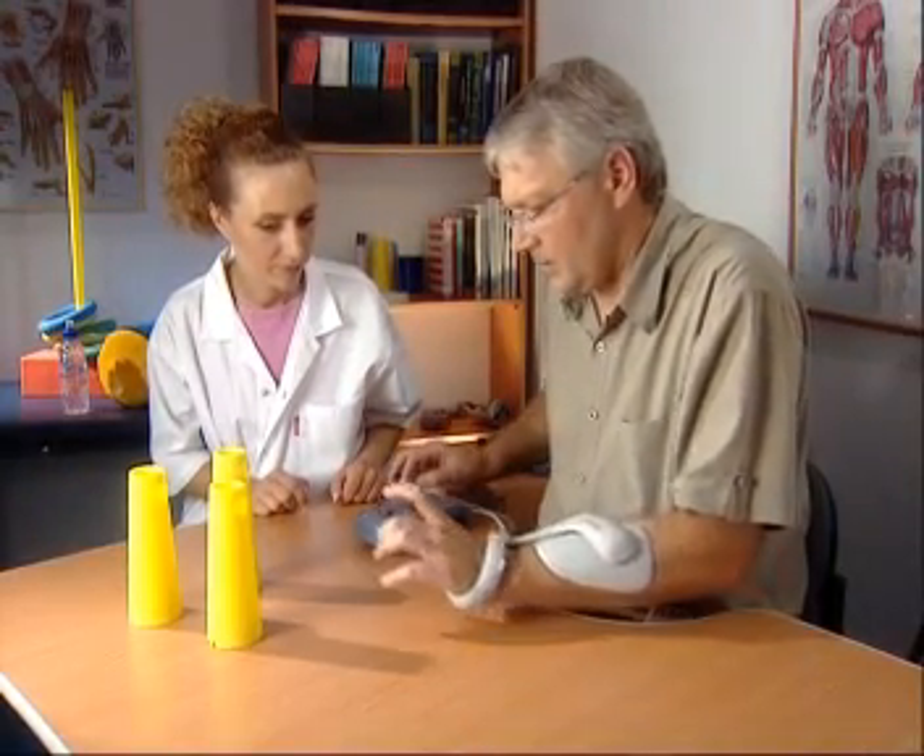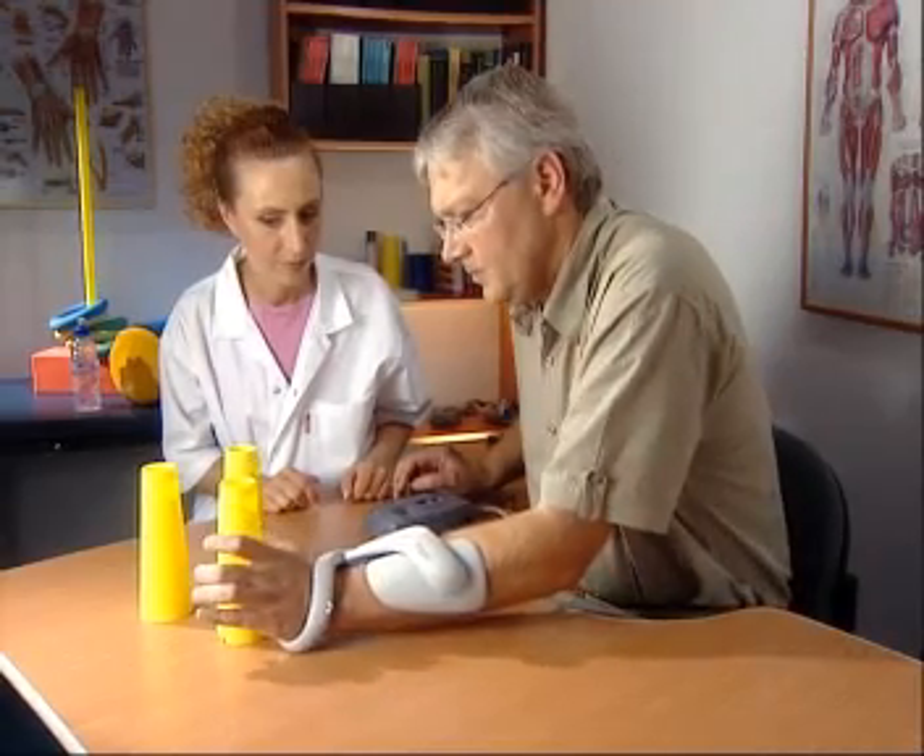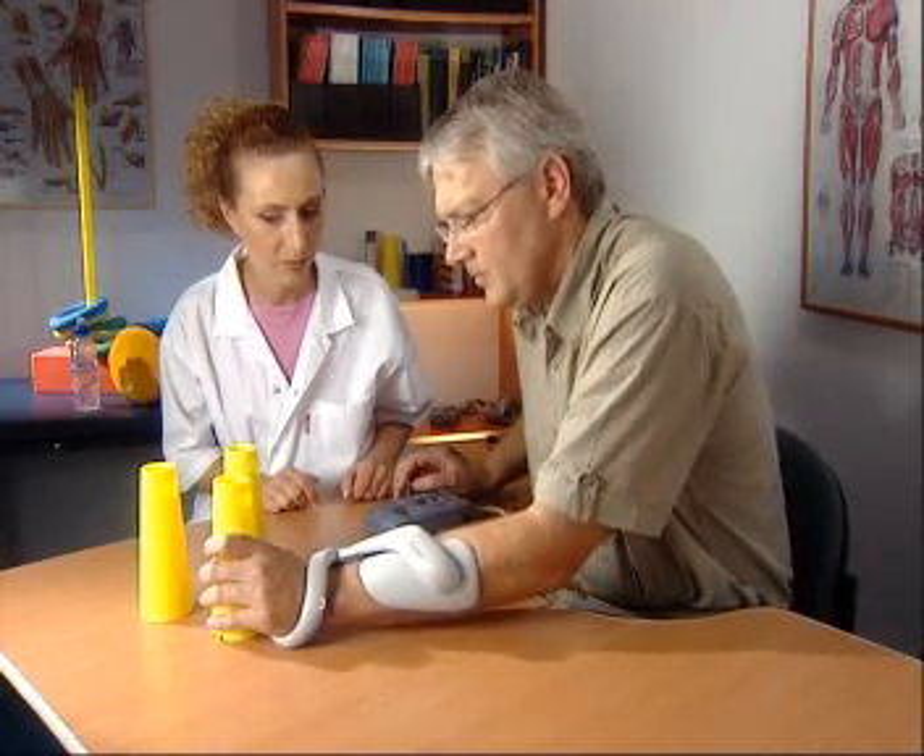Intensive use of the Ness H200 starts in the acute care setting shortly after a stroke and continues in outpatient care. Its award-winning design and special technological features enable patients to continue to maximize their rehabilitation by using it at home, despite motor deficits or other limitations.